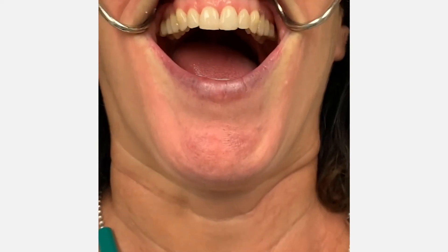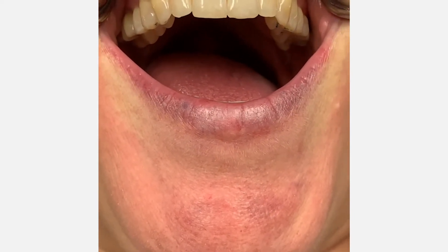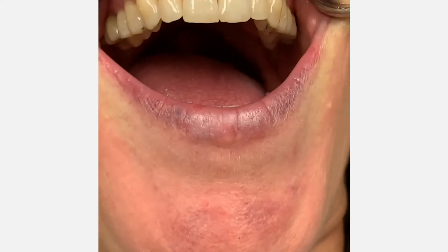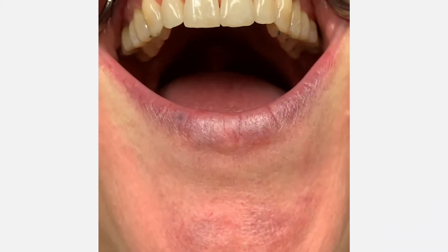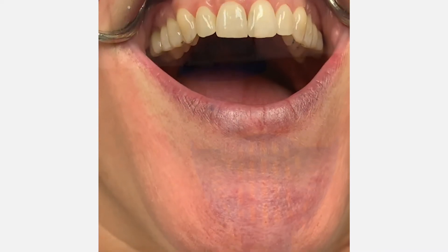We're getting ready to take the full arch impression and I like to use metal cheek retractors. As you can see, I have my retractors in place and look at how much access I have to her teeth without her lips being in the way, without saliva being in the way. This is what I really like about this technique — it makes impression taking easy. Let's get started with the impression.